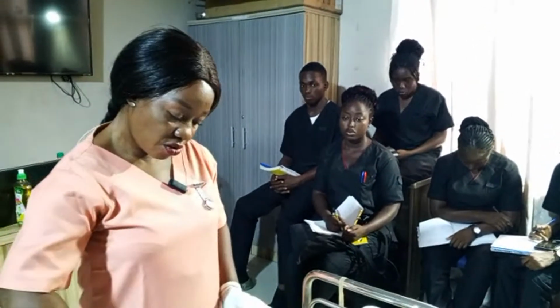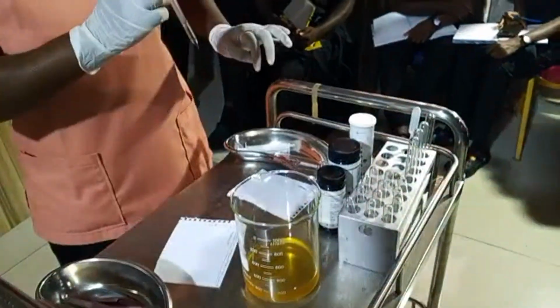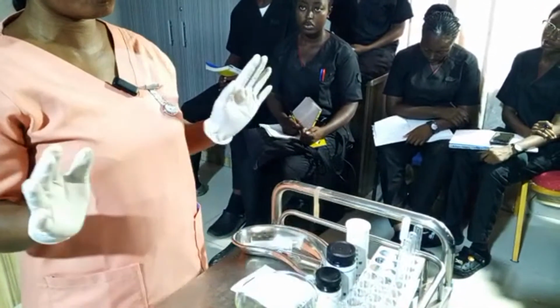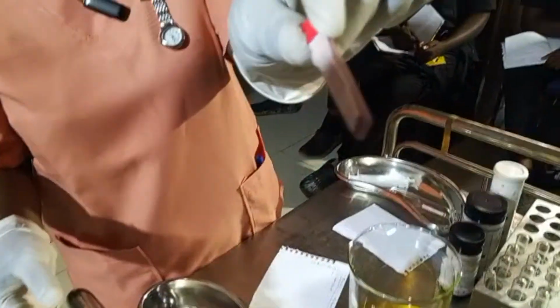So, reaction to litmus paper. I am going to use, so now I'm going to remove my pen and put it inside my pocket because I will start touching this urine. So I will remove one litmus paper. Of course, I'm using red litmus paper, as you can see.